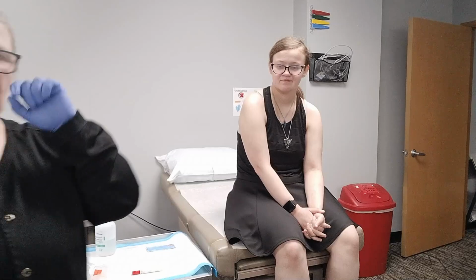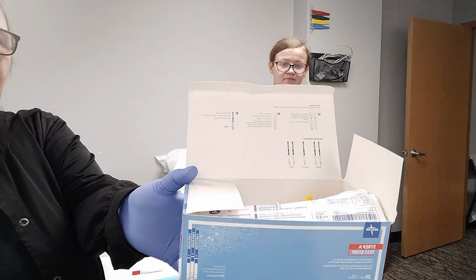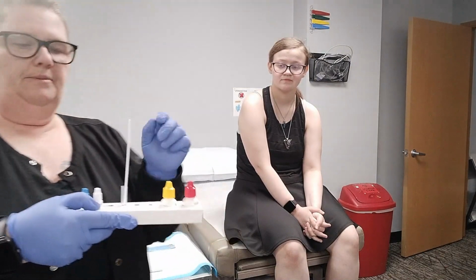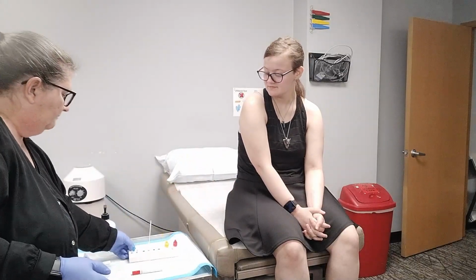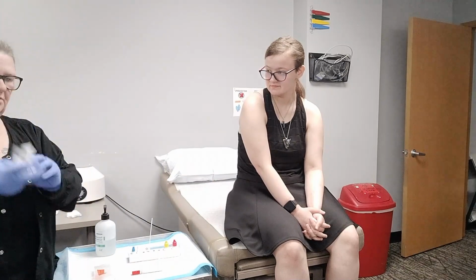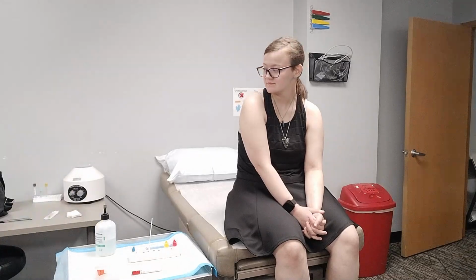And as I had noted on the past video, here is the box that this came in, and the directions are right on the lid of the box. Okay, so it says to rotate about 10 times, which I did, and then we're going to let it sit for about a minute. So we're just going to let that sit in there like that. While we're waiting, we can go ahead and get rid of some of our garbage, which will just go into the regular trash.